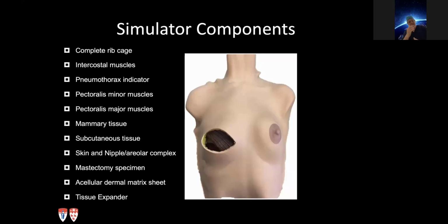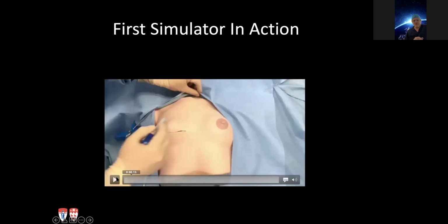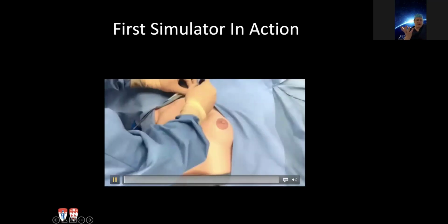I remember in those years, with that simulator, we did not use any 3D printing. Now we have moved on with new technologies, and the huge 3D printer we have in the lab can facilitate the process, but there's still a lot of hands-on work. The students who work on that have to have a certain engineering component. They need to be able to build something in order to get a real simulator going. And then you get a simulator which is pretty close to what you would see in an operating room.